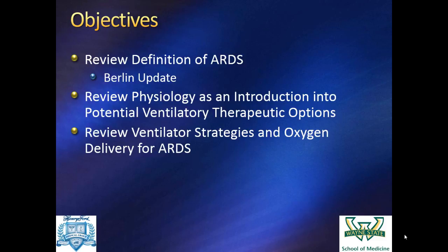So even though we talk about high levels of PEEP and might worry about their effect on the right heart and on the pulmonary vasculature, you don't really know what the effect of that is unless we do what we used to do. One of the interesting things about the EXPRESS trial, where they set a plateau pressure of 30 and said as long as the plateau doesn't exceed 30, it's okay to increase the PEEP. The idea for that trial, which did show a better mortality with that method compared to low PEEP, is that as long as there was recruitable lung, the plateau pressure should not increase with augmentation of PEEP.